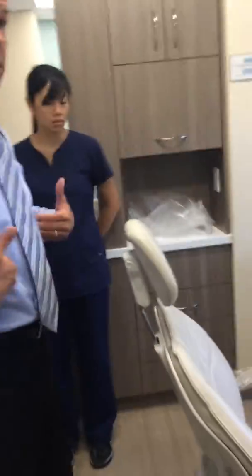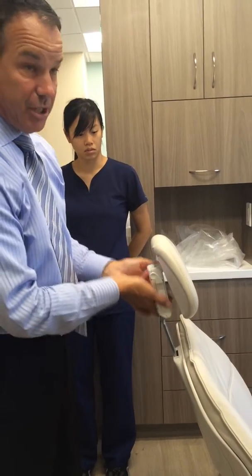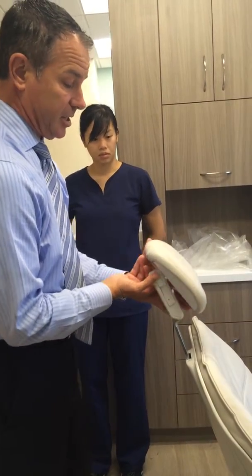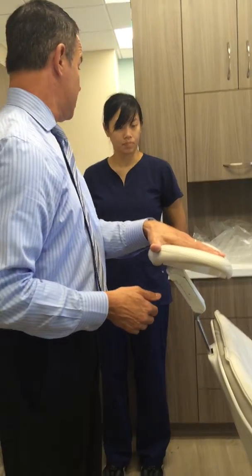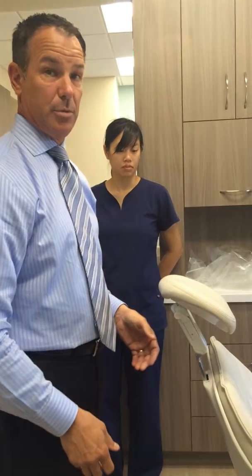Depending on the torso length and the neck length of the patient, we want to then adjust this up and down. We're going to push this button here, and then this allows this to come in and out and go this way as well. What we're going to do is take this curve of this headrest and place it at the base of the occipital. Okay? The reason for doing that is now I've got support, patient support, so that their chin's up.